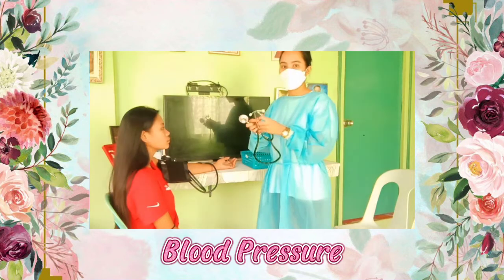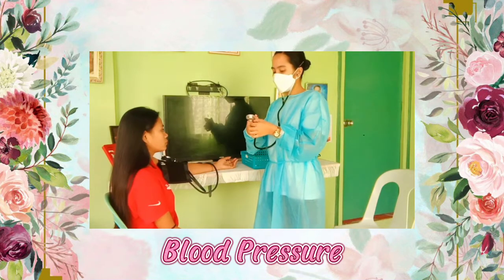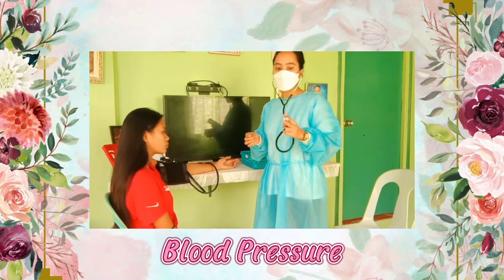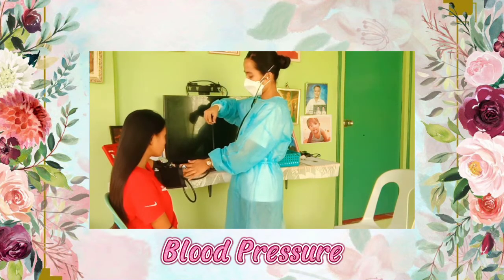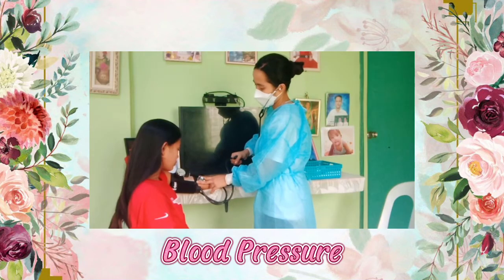Place the stethoscope earpieces in the ears and be sure that sounds are clear. Hold the diaphragm of the stethoscope using the index and middle finger to make sure that you're not hearing your own pulse and place it on the brachial artery. Close the valve of the pressure bulb clockwise until tight. Quickly inflate the cuff above the patient's estimated systolic pressure.